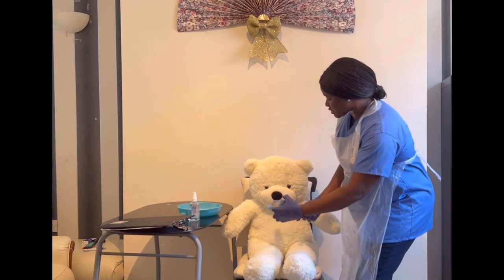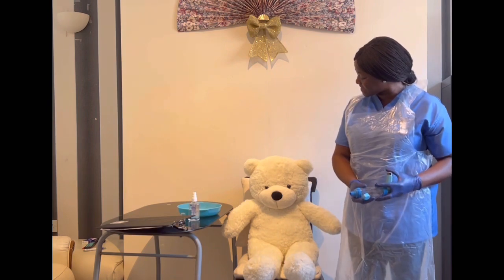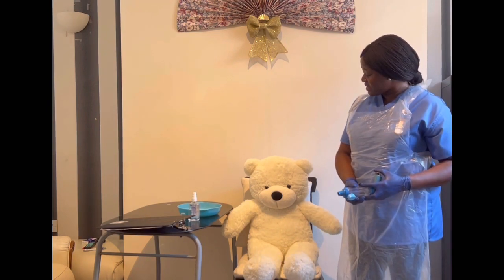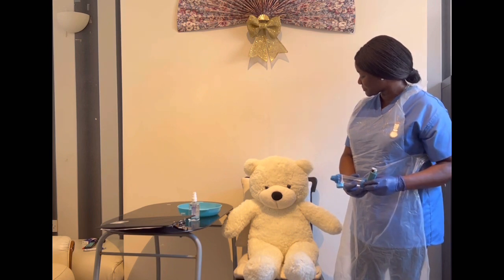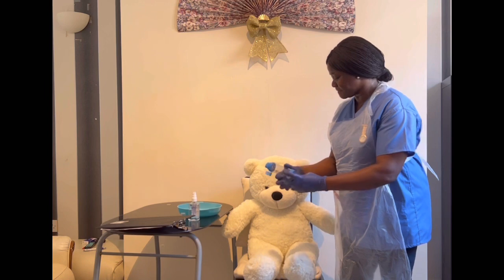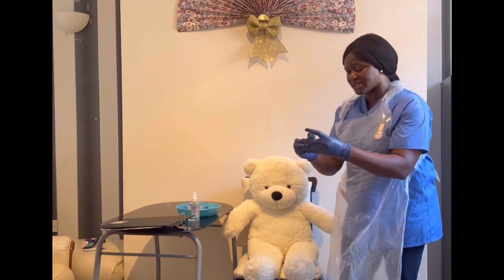I'm going to remove the spacer. Can you hold your breath for 10 seconds or as long as your capacity can carry? Wonderful, Harry. 7, 8, 9, 10. 10 seconds is over. Can you breathe out slowly through pursed lips? Okay, that's perfect. Okay, and I'm going to put this back.